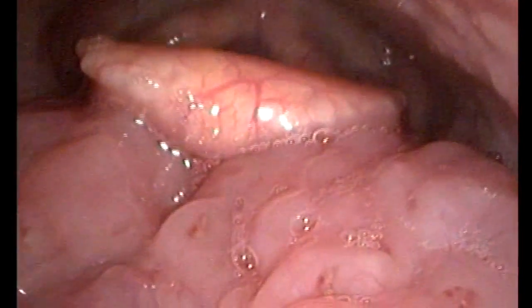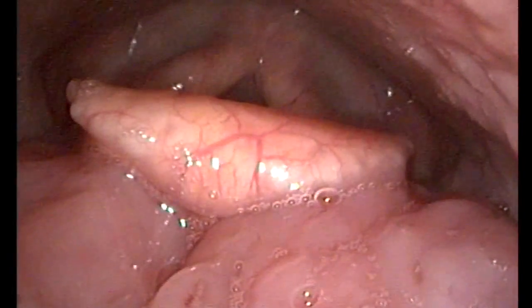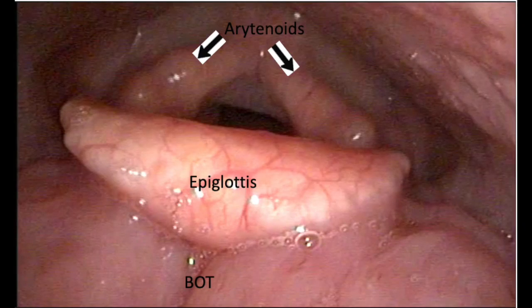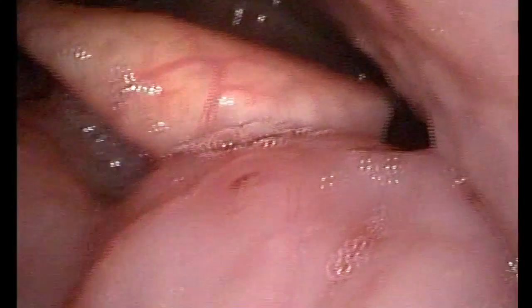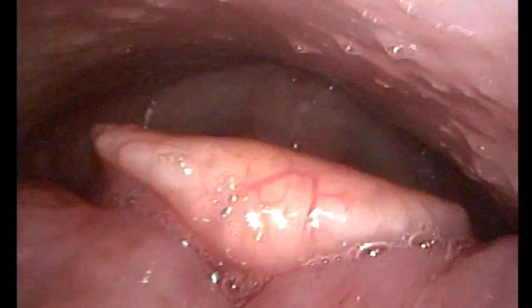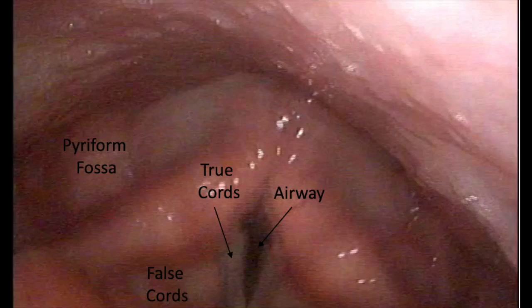As you pass further forward you will head towards the post nasal space and the nasopharynx. Aim the endoscope inferiorly down towards the hypopharynx and larynx. Now other structures will come into view: the base of the tongue, epiglottis, arytenoids, true cords, false cords, pyriform fossa, and the airway.